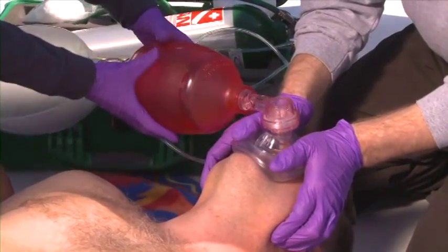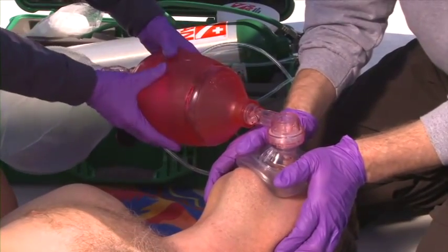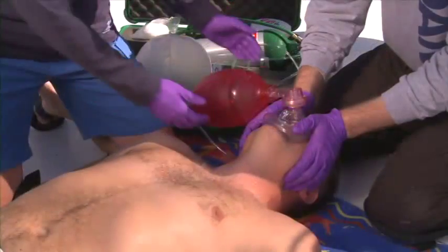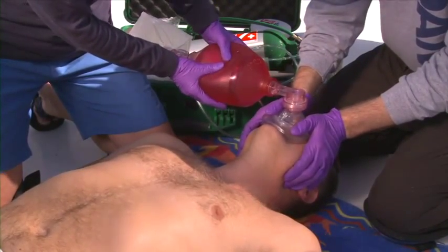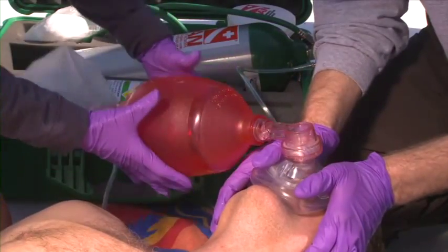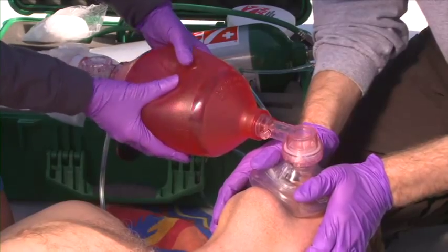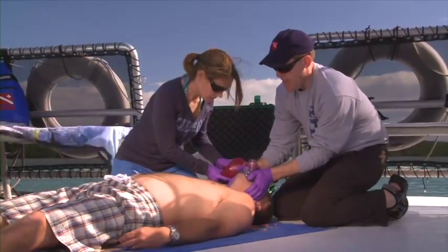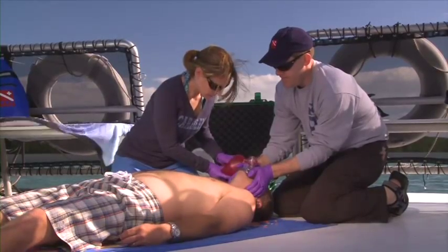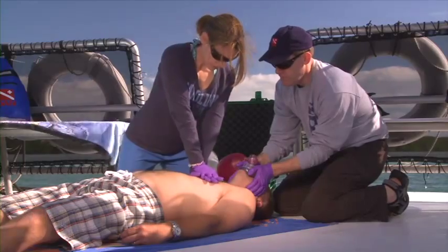To ventilate, your partner should use two hands to squeeze the bag enough to create a visible rise of the chest. This only requires about one-third of the bag volume. Each ventilation should be smooth and last about one second. Provide continuous cycles of 30 compressions and two ventilations. Always allow for full exhalation of the first ventilation before providing the second one.